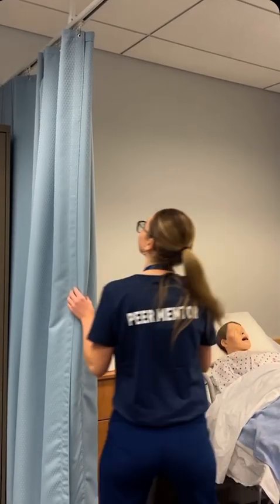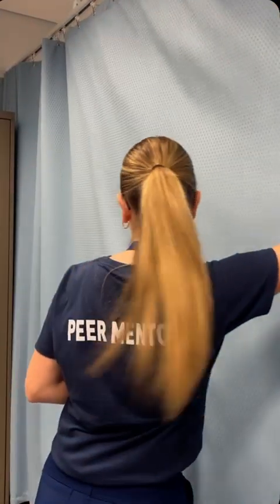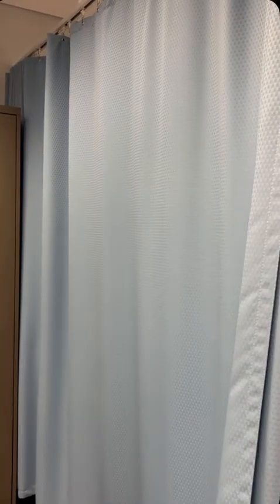Performs the skill in a timely manner. Communicates therapeutically with patient and client throughout the procedure. And finally states what would be documented.